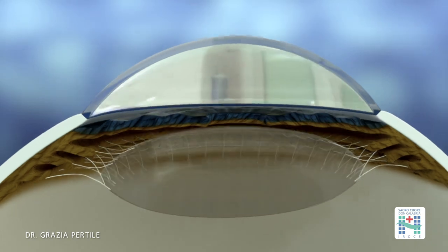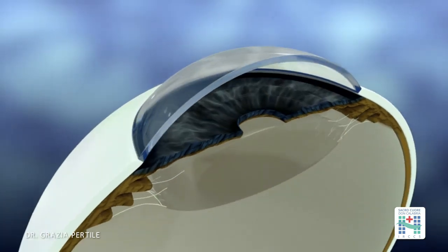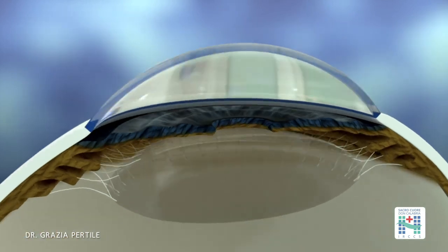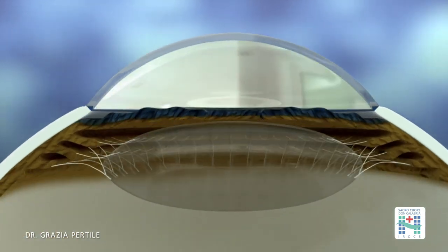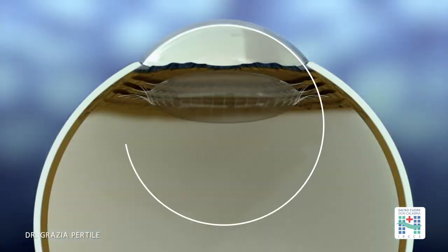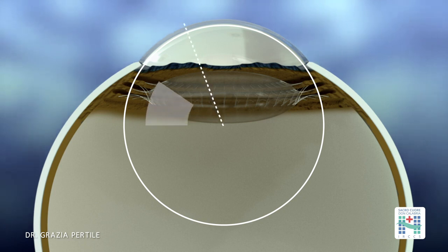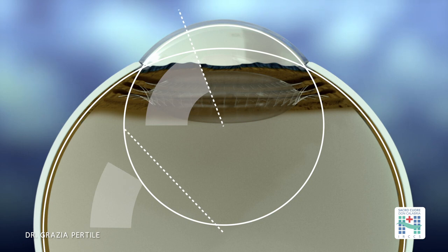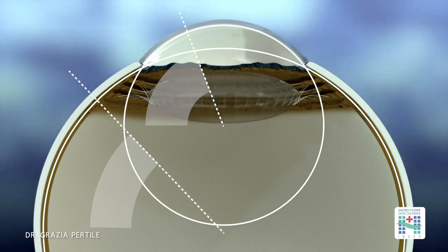Specifically, it is essential to restore the eye's integrity, minimizing scar tissue formation and its subsequent impact on transparency, while preserving the regularity of the curvature as much as possible. Since irregular astigmatism cannot be optically corrected, it's important to keep in mind that the cornea has a curvature radius of about 7.5 millimeters, while the sclera has a much larger curvature radius, generally over 10 millimeters.